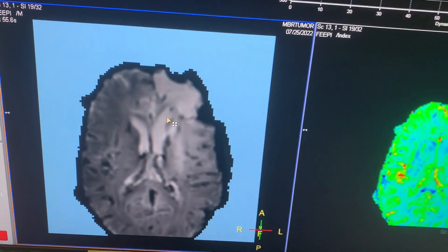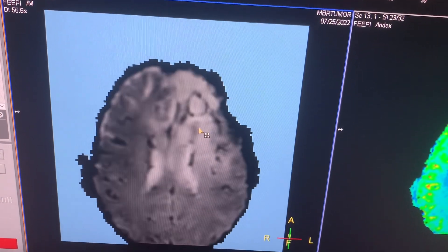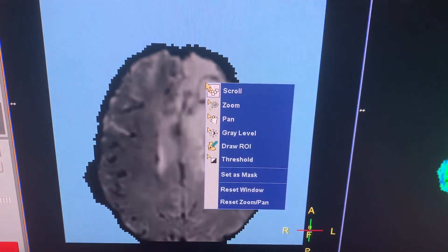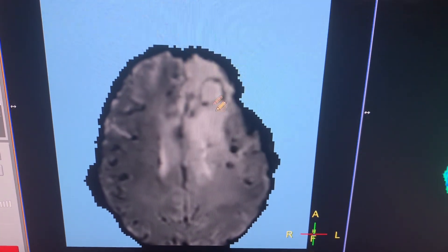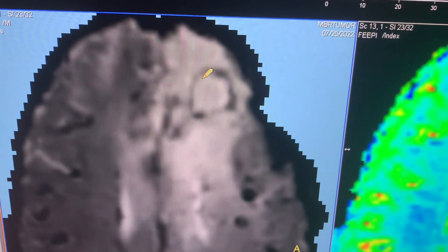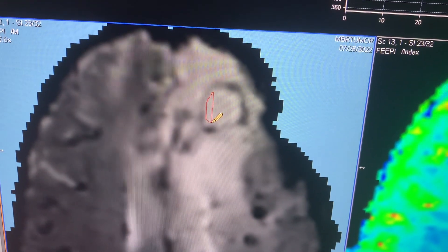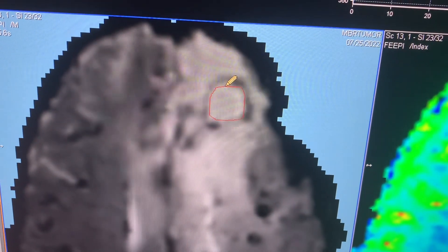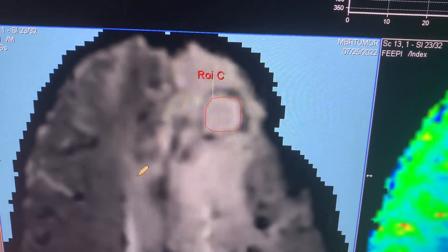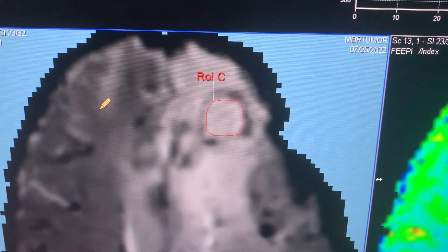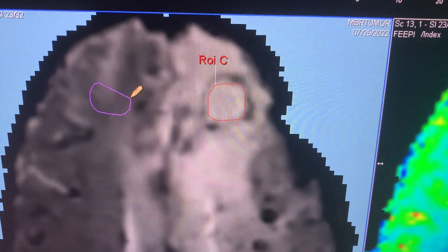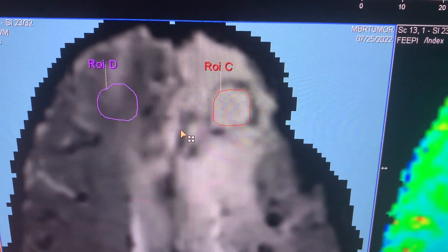Go back to the bottom-left corner, go in and out of slices to find your tumor, and right-click to draw an ROI around the tumor. You can zoom in for more accuracy. Then draw a second ROI on the contralateral side — the opposite side of the brain — approximately the same size circle.